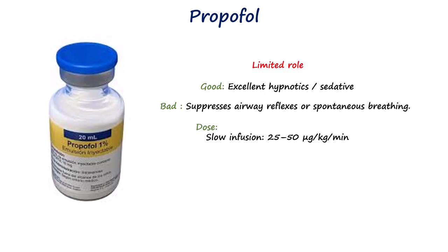Some anesthesiologists keep it as a backup, giving tiny boluses of 10 to 20 milligrams if the patient becomes too anxious or uncomfortable.